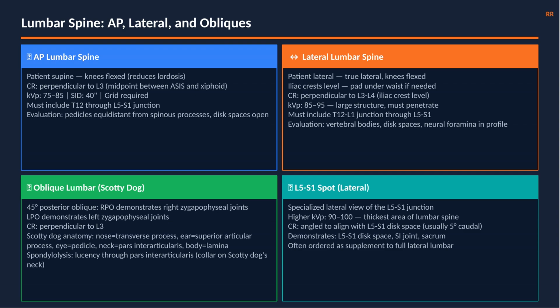Spondylolysis, a stress fracture of the pars interarticularis, the Scotty dog's neck, appears as a lucency through the neck, like a collar on the dog. This is one of the most directly tested oblique spine findings on the ARRT.